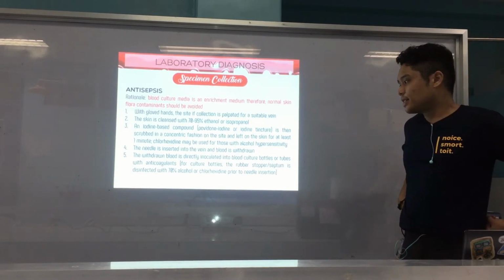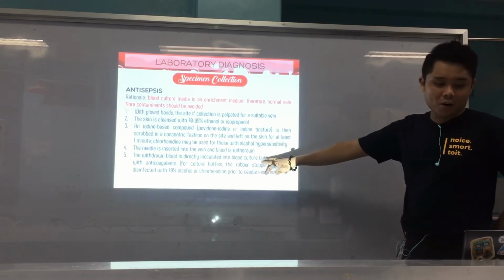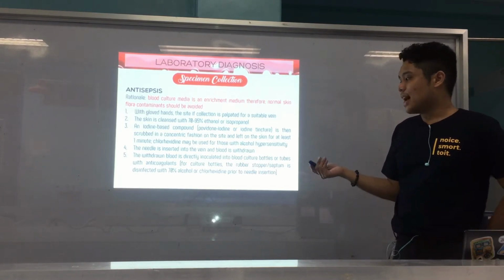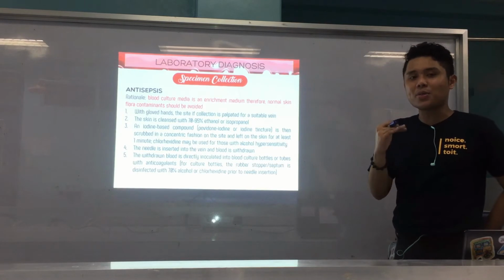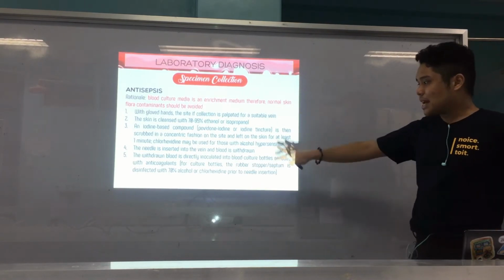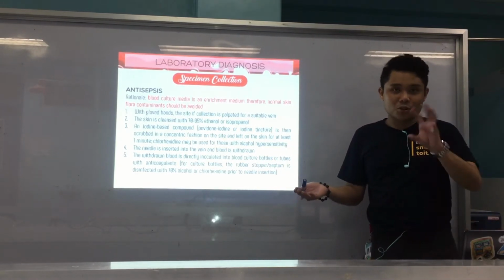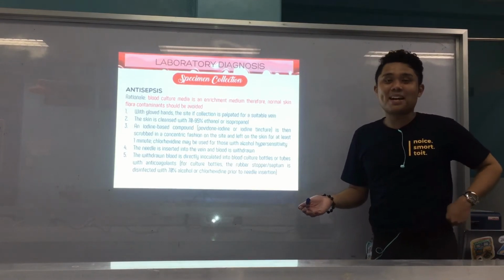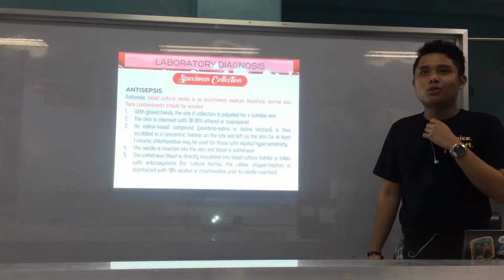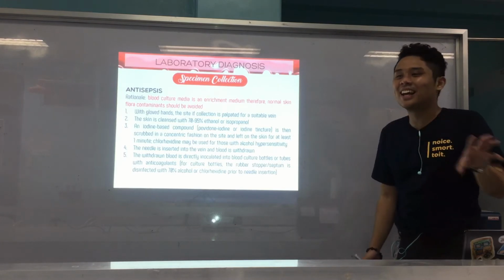Alright? Okay, and another thing here is, ang withdrawn blood or ang gikuha na blood kay directly put into culture bottles or imuhang tubes with anticoagulants. Now, why do you think so? Why do you think blood should be put directly in a tube or bottle na naay media, blood culture bottles, or if wala blood culture bottles kay, unsa na tube gani for blood culture, di ba yellow, di ba for microbiology, so yellow. Why do you think so? Naibutang siya dapat o anticoagulated tube?